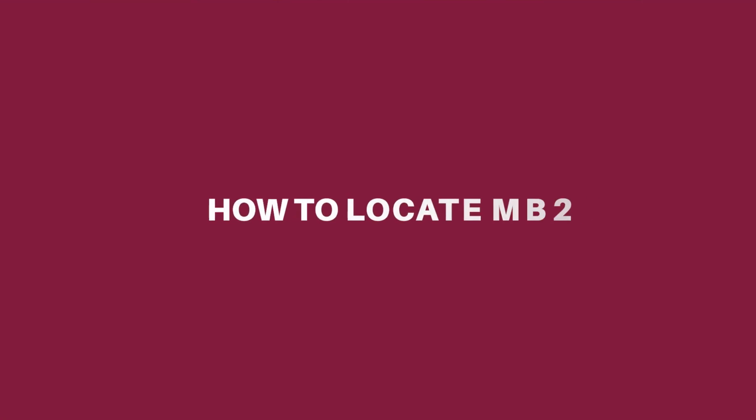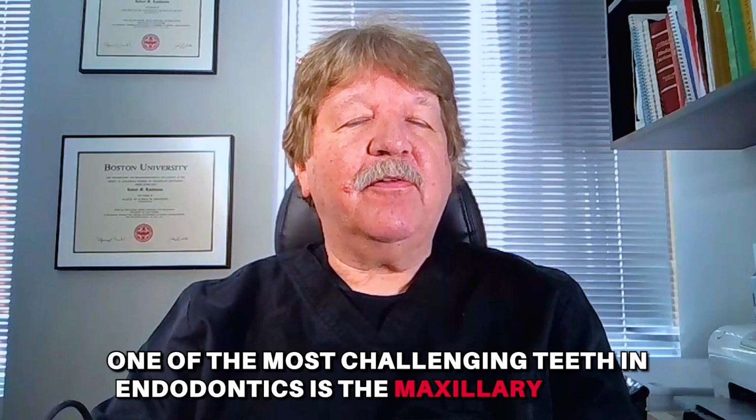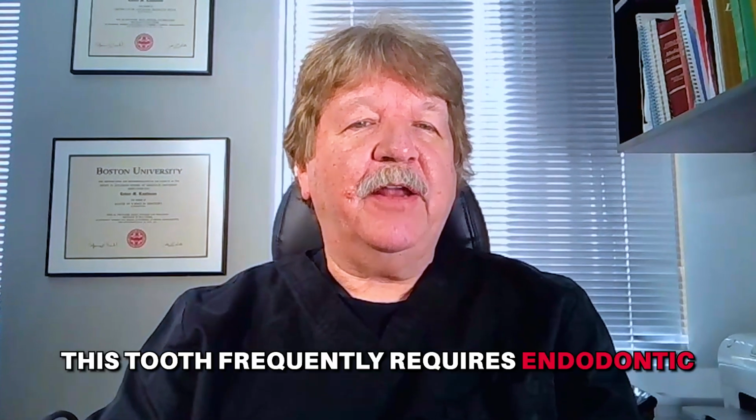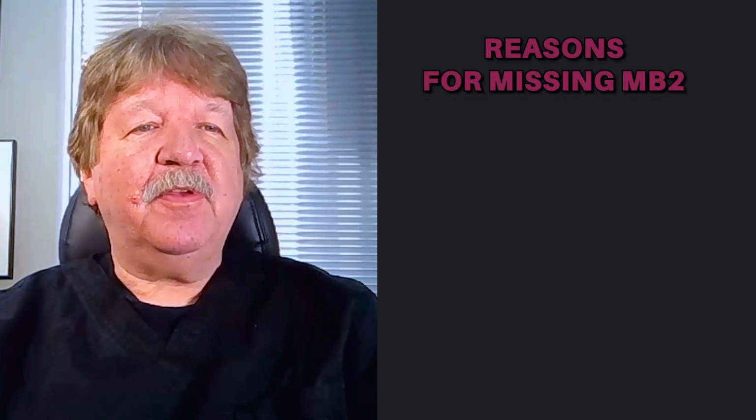In this session, we're going to find out how to locate MB2. There's no question that one of the most challenging teeth in endodontics is the maxillary molar. This tooth frequently requires endodontic retreatment because of a missed MB2. The reasons that clinicians miss MB2 are varied.